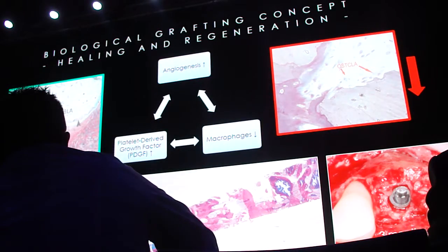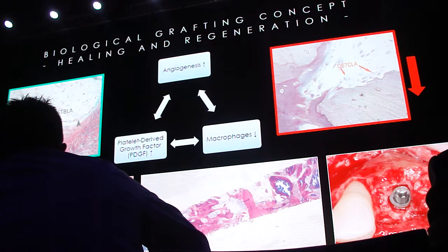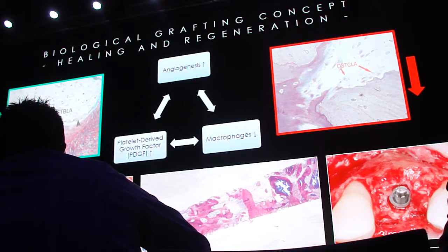So the idea of the biological concept is based on using thin bone membranes in combination with bone chips. The idea is to accelerate the revitalization of this graft, to create new bone formation, to stimulate the cells and the blood vessels, making this tissue stable long-term.